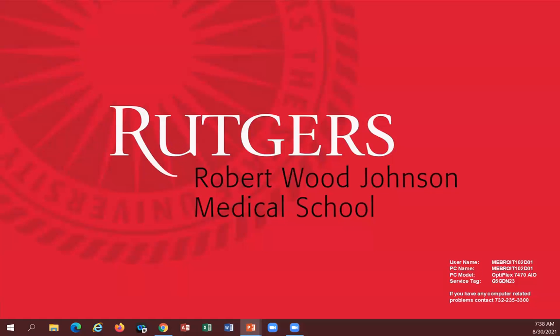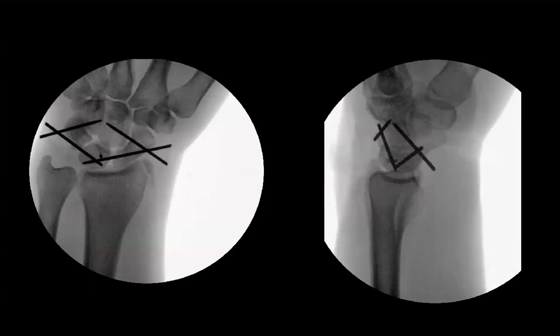What was the pathology on the transradial styloid fracture? What ligaments were repaired? So we repaired the SL ligament posteriorly, dorsally rather. And where did that come off? It came off of the lunate. Is that an anchor in the lunate? It is, correct. And are you saying that the ligament attaches to that spot where the anchor is? Intraoperatively, it seemed that the ligament was attaching in that position, so that's where we anchored it.